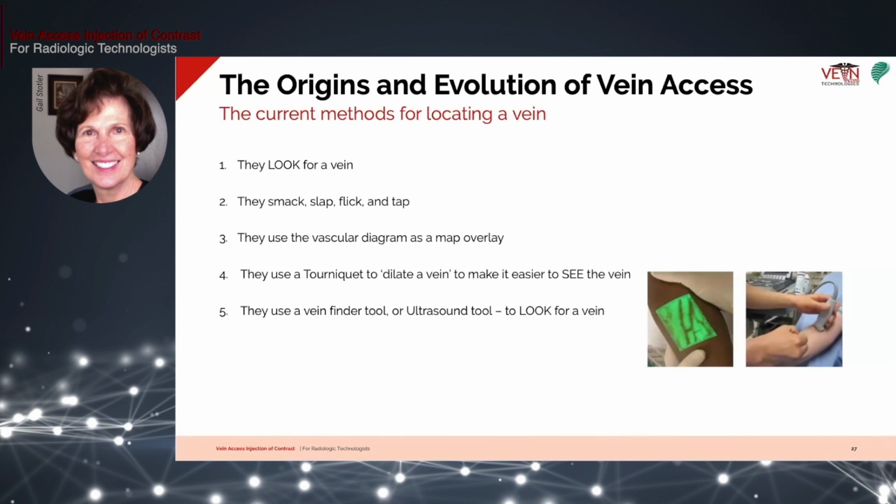And approximately 50% of the veins you and I are going to have to access for healthy veins aren't visible with that vein finder tool. Even when you locate it with our technique, they're still not going to be visible with that tool. And even if you use the ultrasound, you really still don't know about vein wall thickness, characteristics that we're going to need to know before we stick the vein to determine if it's a vein that's going to tolerate the stick, what size is it, etc.